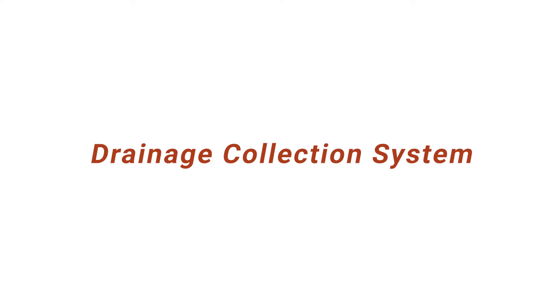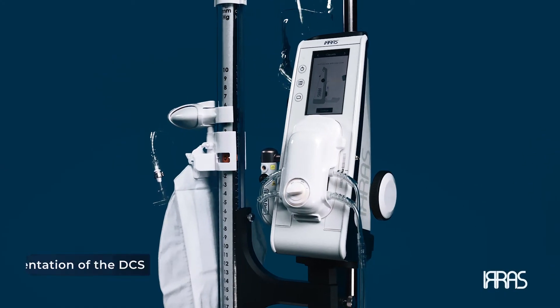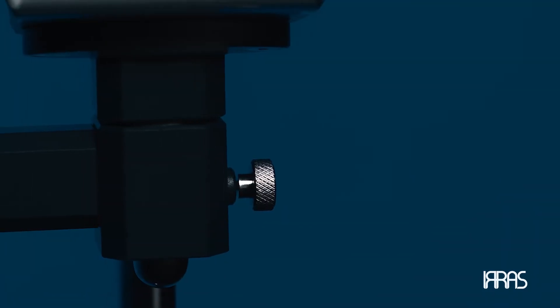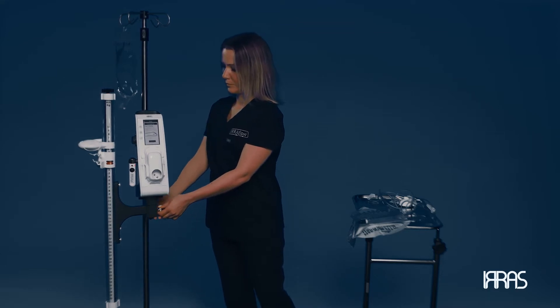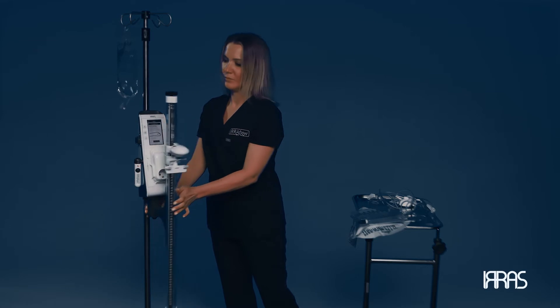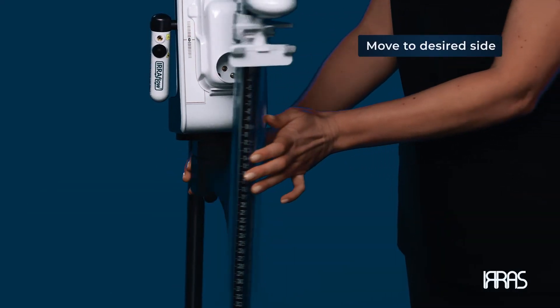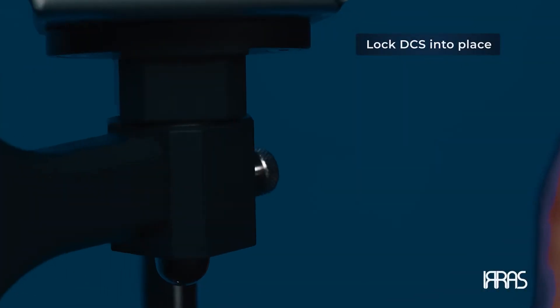Drainage Collection System. Select the orientation of the drainage collection system in relation to the patient. Locate the pin at the area of connection between the drainage collection system and the airflow control unit. Pull the pin backwards to release the locked drainage collection system, allowing it to be moved from left to right. Set the drainage collection system to the desired side and release the pin.